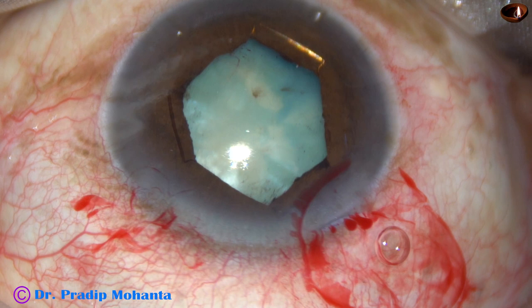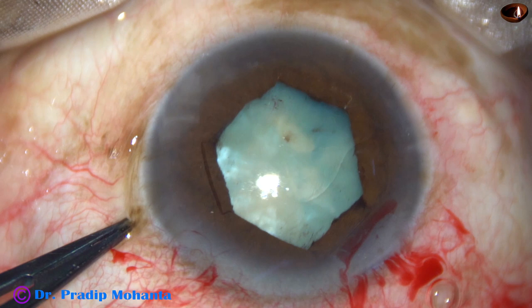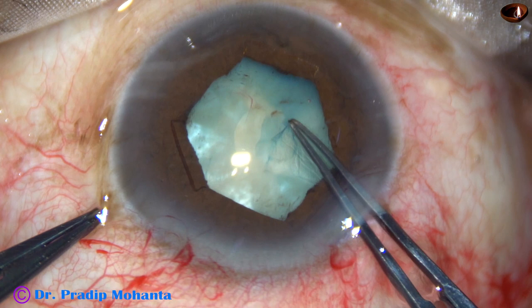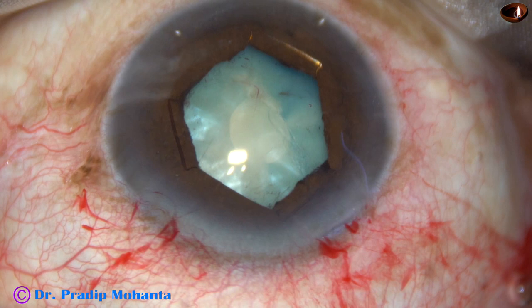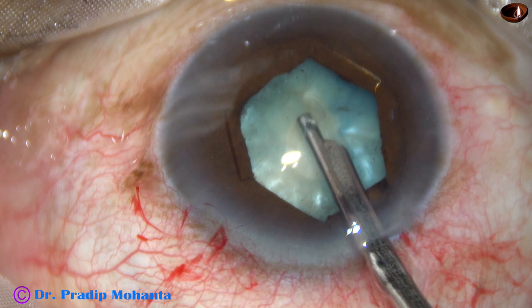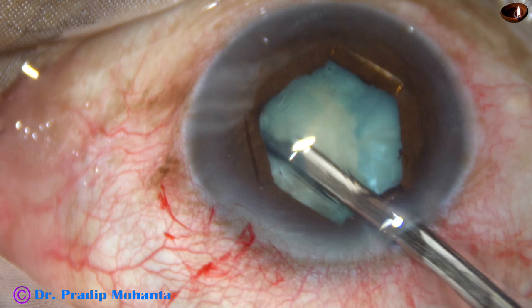Now see what happens. As soon as I incise the anterior capsule, there is leakage of turbid fluid, indicating high intralenticular pressure. In such cases, I always do a small rhexis first, aspirate some cortical matter and decompress the capsular bag. As soon as we aspirate some cortical lens matter, the intralenticular pressure decreases drastically. There is also some dye under the iris that is coming out occasionally.